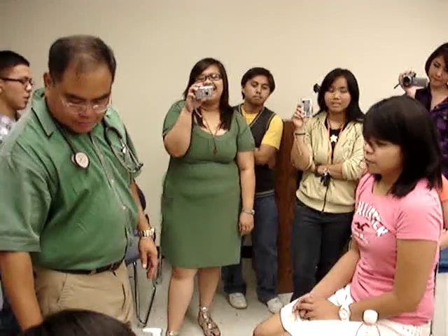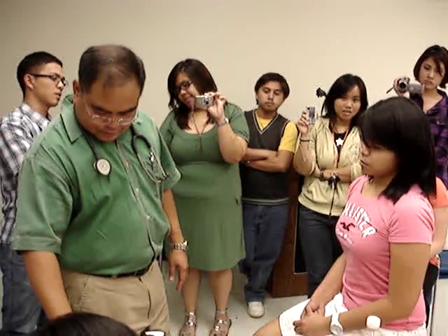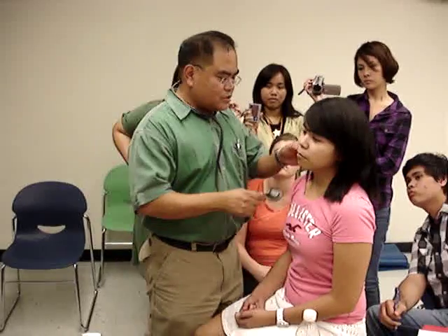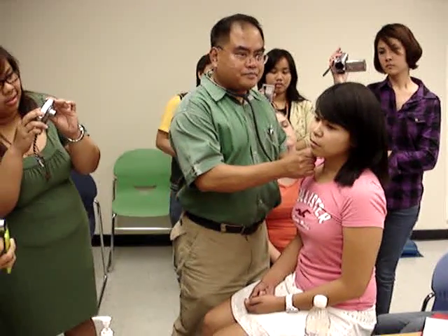So right now I'm just going to inspect the precordium, check for any discoloration or any pulsations. There's nothing really to palpate or percuss, so I'm going to go from top to bottom and check the carotid. If you're using one of these stethoscopes, you need to switch to the bell. So I'm going to check for carotid.